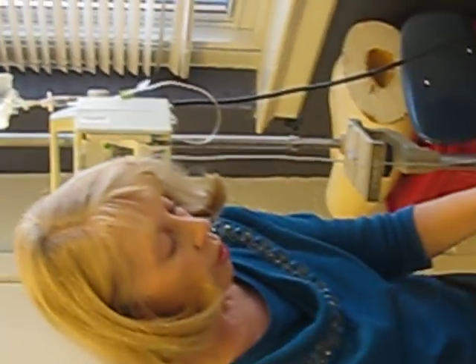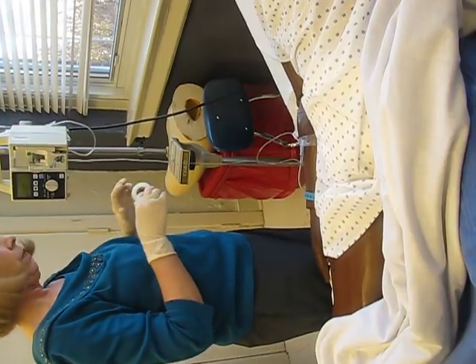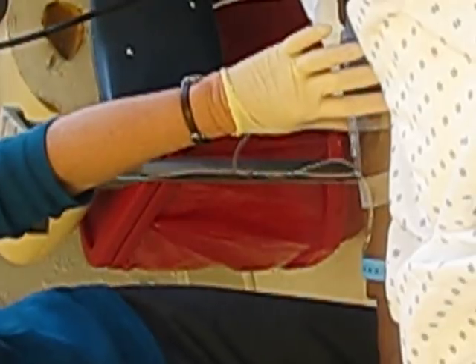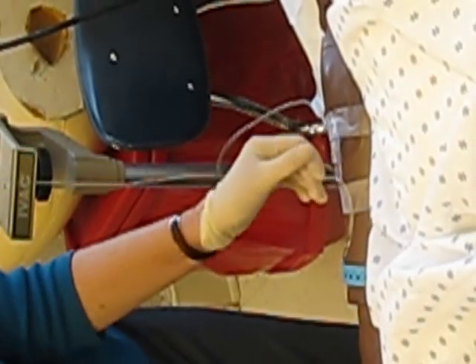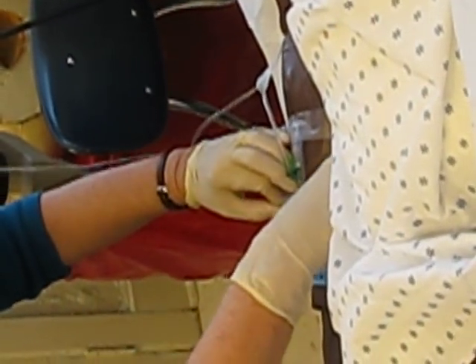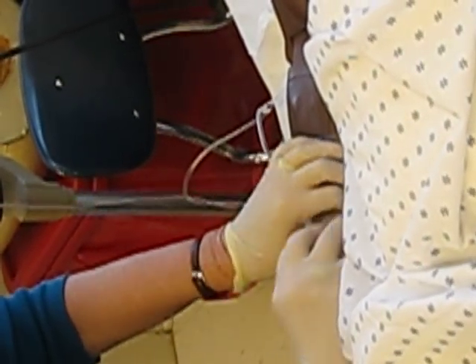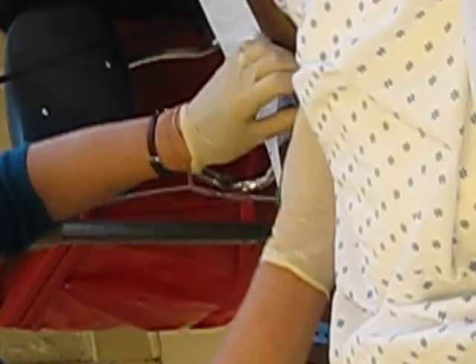And so this is what I want you to do to secure the tape. Go ahead and put a piece down here to secure. This will either be an op-site clear plastic type of dressing or it'll be clear tape, depending on what they use. And so we have secured it. I want you to make a U-type turn with your tubing. Don't make a V, because that will cut your tubing off. I want you to make a U and come above the dressing.